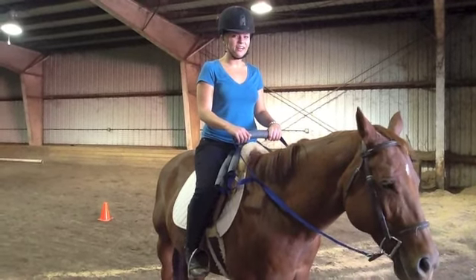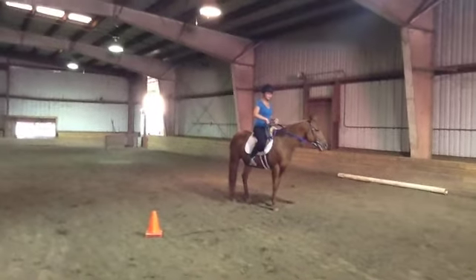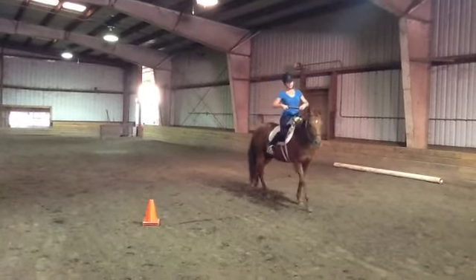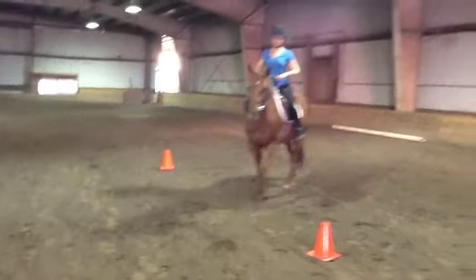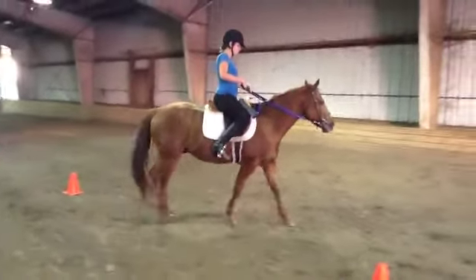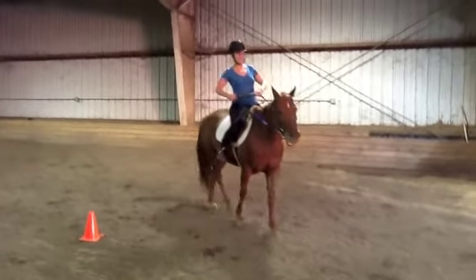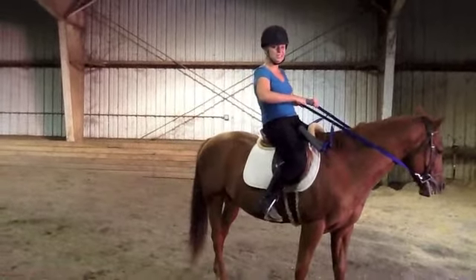Now, I'm going to demonstrate how to use the adaptive ladder reins. I'm going to pull back on my right arm to steer right. And pull back on my left arm to steer left. Come back again to the right. And this is my first time on a horse, so you know it's easy to use.